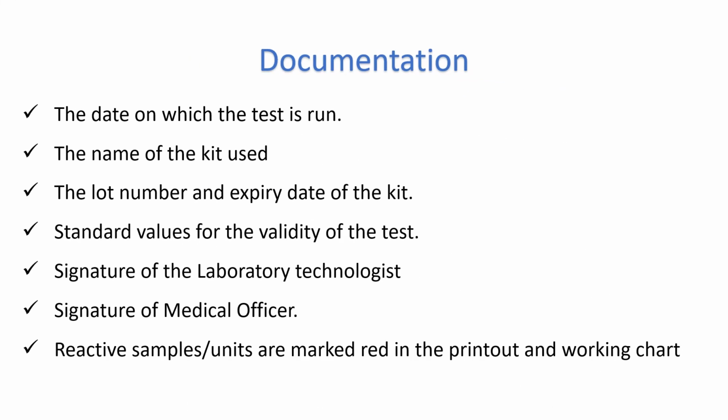And documentation is a very important part. So the date on which the test is done, the name of the kit used, the lot number, expiry date of the kit, standard value for the validity of the test, then signature of the lab technologist and the medical officer. Reactive units and samples are marked red in the printout and working chart.